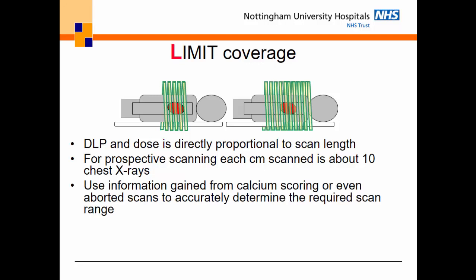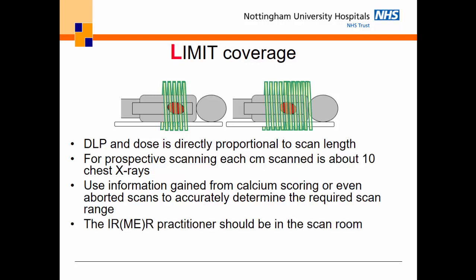You should use information from calcium scoring or even aborted scans or even previous imaging to work out the exact scan range that you need. Okay, so you need to make sure either you or the operators that are driving the scanner make use of that information.